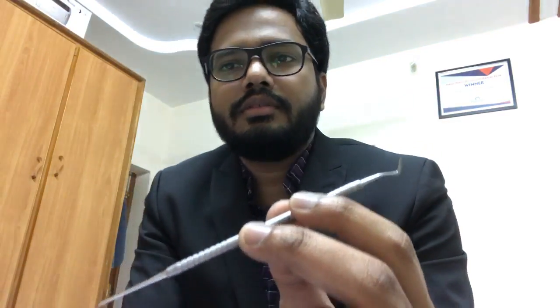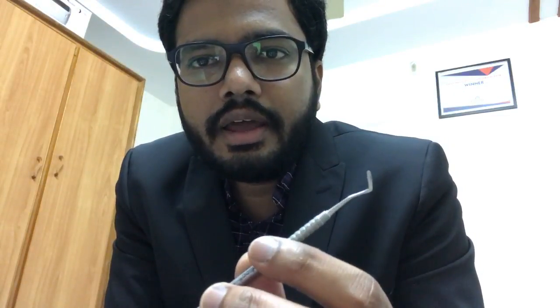So identify this instrument. So this is one end of the instrument, and this is the other end of the instrument. I think you can identify this instrument clearly, right? So what is the name of this instrument and what is its function? One end, we have a flatter end. The other end, we have a cylindrical end. If you observe, it's a cylinder, right? Yeah, one end is for carrying the cement, the other end is for condensing the cement, right?